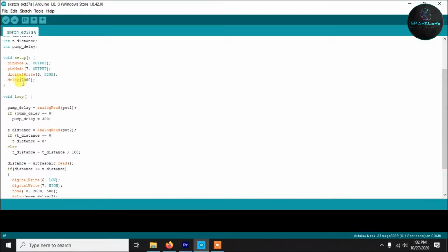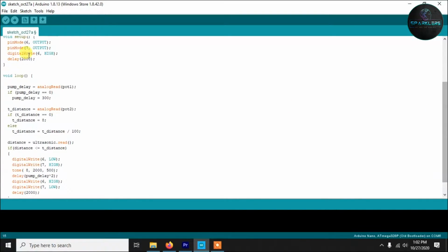Now finally we are giving it a delay of 2000 milliseconds, which is 2 seconds. This is because whenever we turn on our sanitizer, it will wait for the first 2 seconds and will not work, and after that it will start working. Obviously you can delete this line if you don't want this.